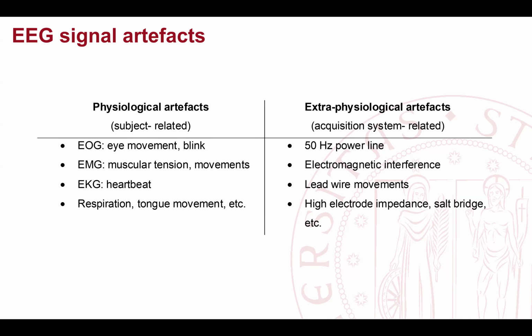So most of the time, what we do in a BCI application, for example, is try to work around the noise in the application. We concentrate our analysis on very specific features that we know are not affected by noise. In case they are affected by noise, I try to counteract, for example, through the robotic behavior, through some other type of strategies. I would say that currently there are no ways of cleaning the EEG signal in real time. When we talk about EEG cleaning, I'm talking about offline analysis. When you record the data, you have your data in your computer, and you need to process the data to extract information. But in real time for BCI, it's not practical.